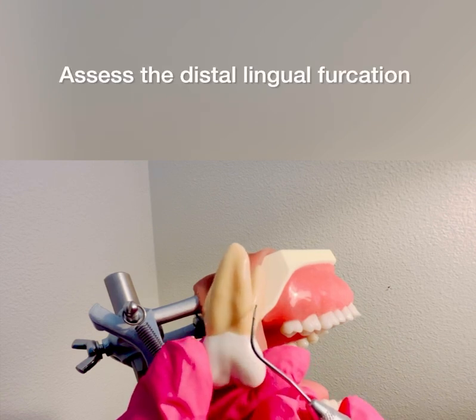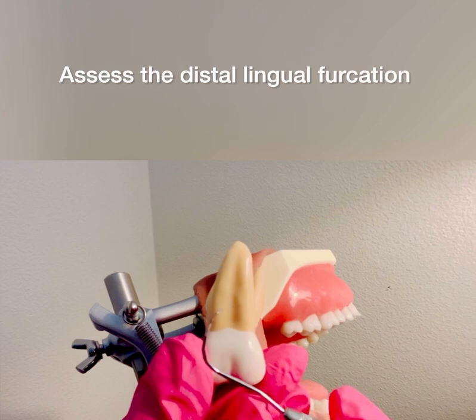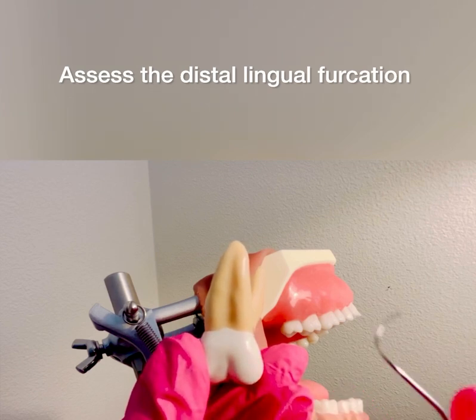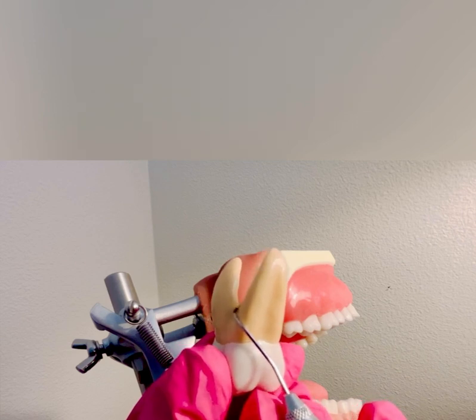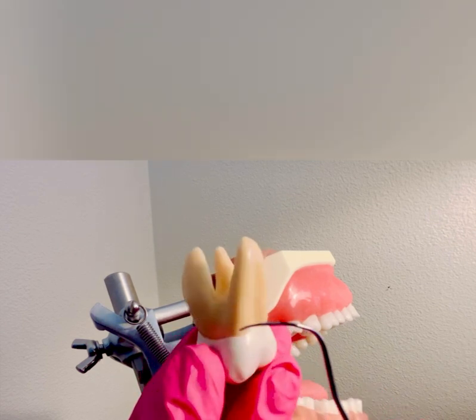You also need to assess the distal furcation on the lingual surface, so I would flip my Nabers probe, make sure I have the correct working end — you can see it rolls and it can adapt right around that lingual — so you would start around the distal line angle, use an assessment stroke, and roll right in between the two roots and assess that distal lingual furcation. Again, this is for the maxillary molar.